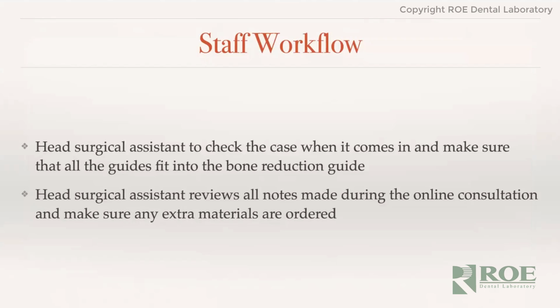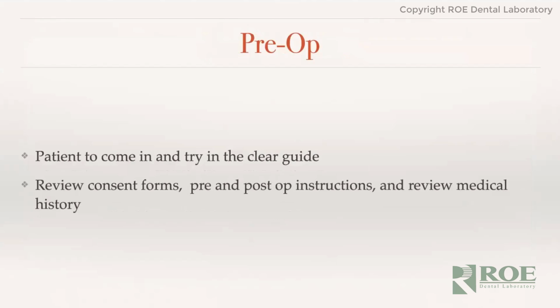When the case comes in, it's the head surgical assistant's job to check the case and make sure that all the guides fit into the bone reduction guides. The head surgical assistant also reviews all the notes made during the online consultation and makes sure any extra materials are ordered, whether it's graft materials or anything else that we talked about, the type of fixation pins, the pickup material, Quick-Up, any of that stuff.